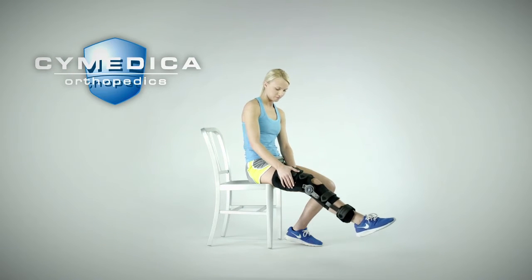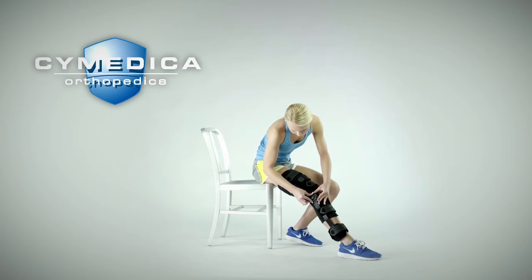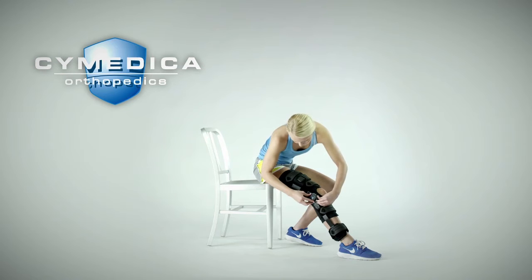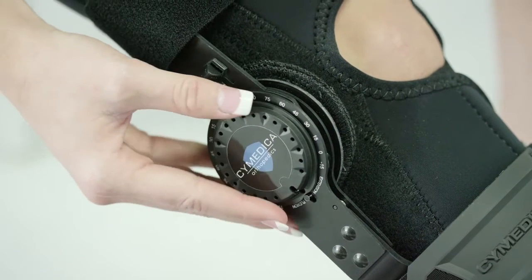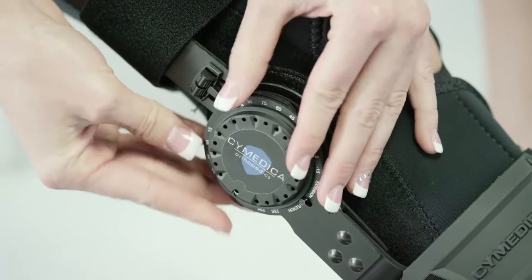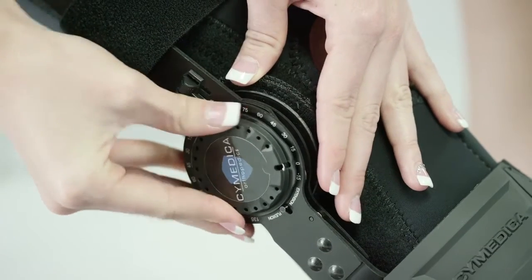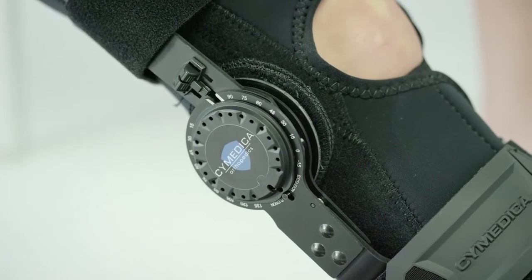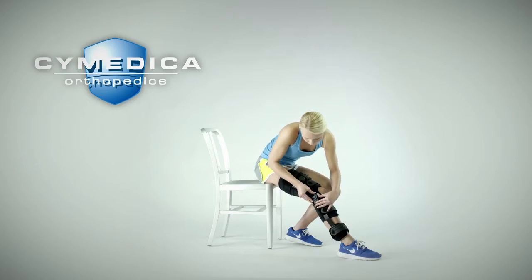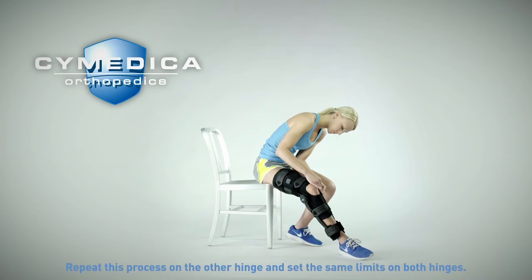The post-operative brace also has the ability to restrict the range of motion of the knee. Always follow the guidance provided by your physician when adjusting the range of motion limits. To adjust the limits, rotate the hinge dial towards flexion and the locking disc will pop out. Dial the disc to the appropriate flexion limit and push the disc back in until the dial releases the disc. Next, turn the dial towards extension and the locking disc will pop out. Dial the disc to the appropriate extension limit and push the disc back in until the dial releases the disc. Turn the dial back to the lock position to prevent unintended rotation of the hinge dial. Make sure to repeat this process on the other hinge as well and always make sure to set the same limits on both hinges.